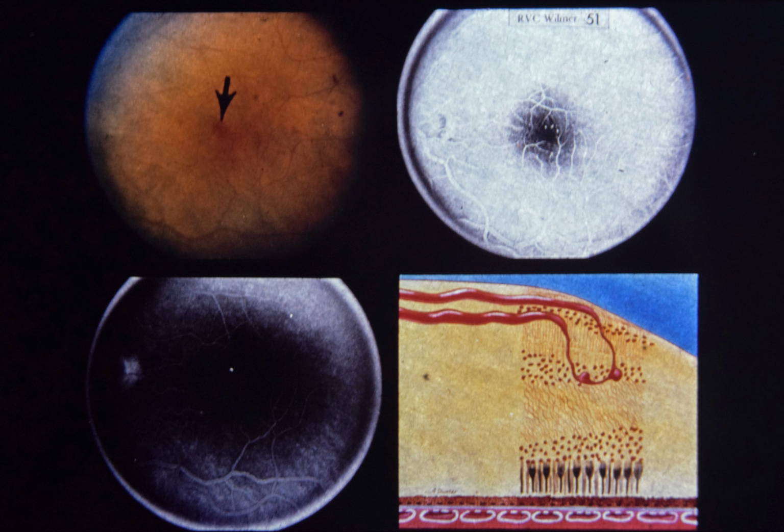Comment: this patient has been followed for 3 years without change in visual acuity or fundus pathology. He has not developed evidence of diabetes, hypertension, or other systemic disease. This is the most subtle vascular abnormality we have seen that is consistent with a morphologic diagnosis of retinal telangiectasis. No treatment is recommended in view of 20/20 acuity and lack of progression in fundus pathology.